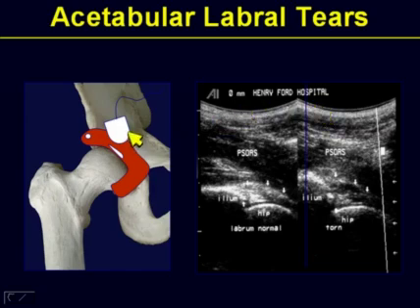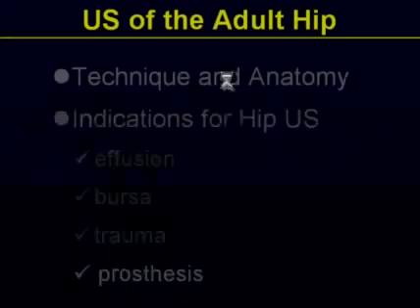So if you put your probe in, let's say, the long axis view, you may see first on the unaffected side the bone acoustic landmarks of the acetabulum and femur and a preserved triangle of the labrum. But as you jump towards the affected side, you see the bone acoustic landmark of the acetabulum and femoral head, but instead of the expected hyperechoic triangle of a labrum, now you see a disruption and a paralabral cyst occurring, clearly now showing acetabular labral tears.